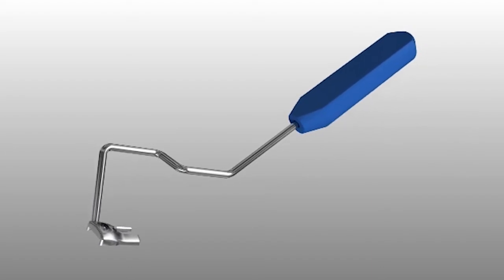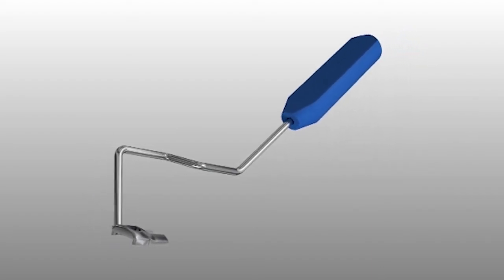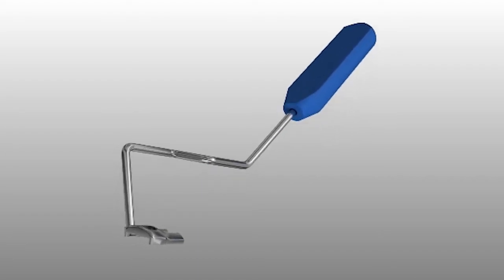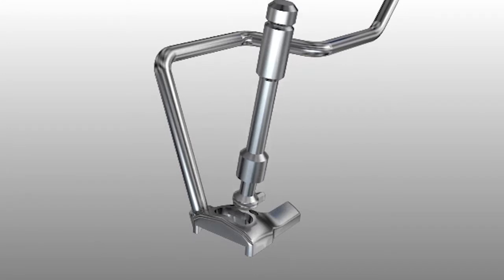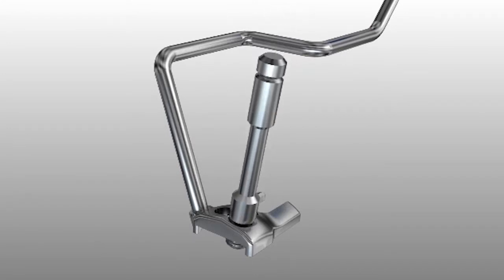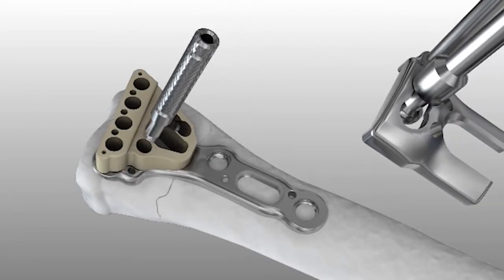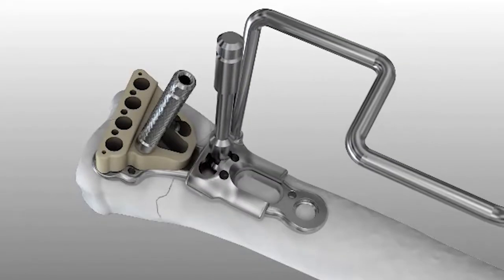The handle assists with precise plate placement while minimizing radiation exposure to the surgeon's hands. To utilize the plate positioning handle, thread the locking bolt into the left side of the keyhole on the distal end of the plate positioning handle base. Once threaded into the base, the locking bolt toggles to fit left and right plates. Thread the locking bolt into the most distal 3.5 mm locking hole on the shaft of any left or right Acculock 2 plate.